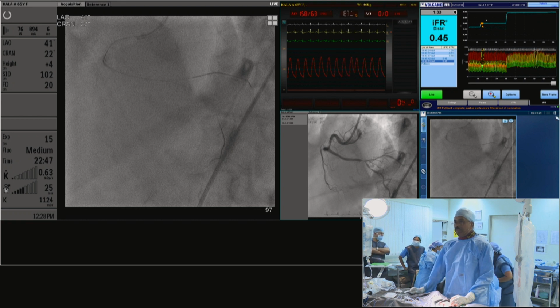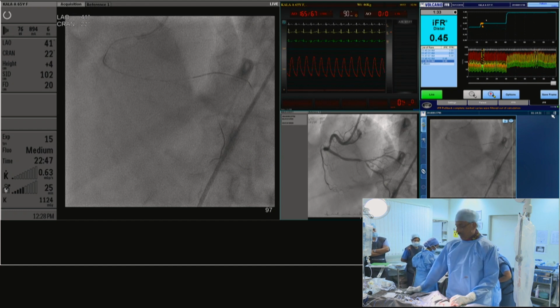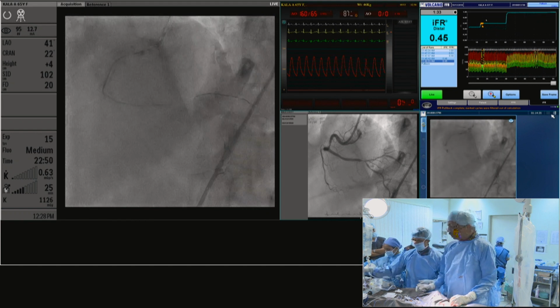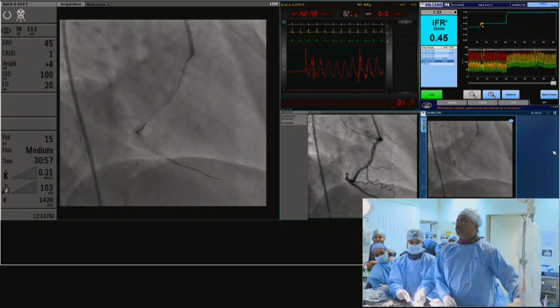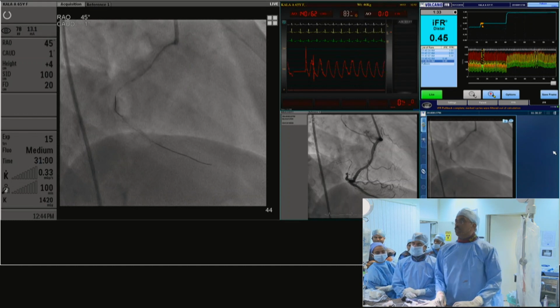So while you're preparing on this, you can go back to Matthew, and then we'll see you once you've implanted the stent distally and decide what to do proximally. So can we then go to the Apollo lab with Dr. Matthew? Sure. So Ajit, what do you have to say? Let's just go back to all the shots.